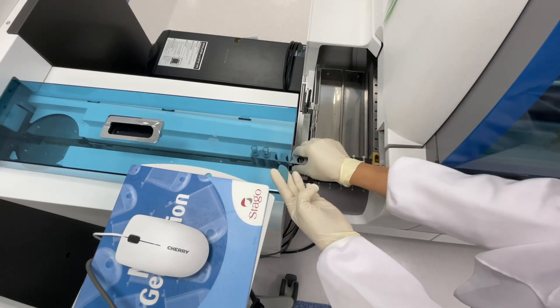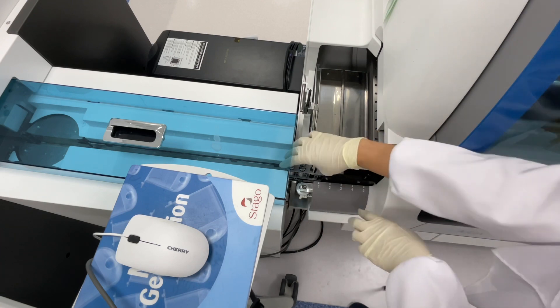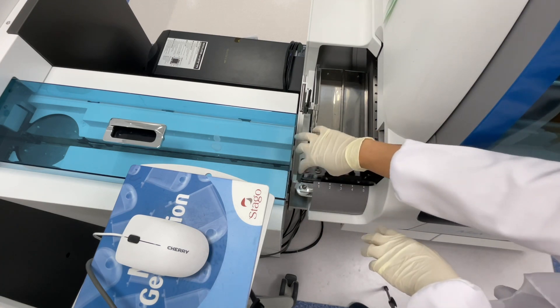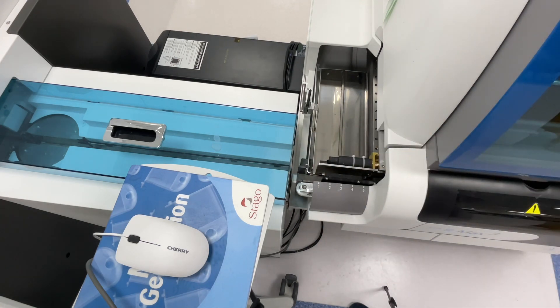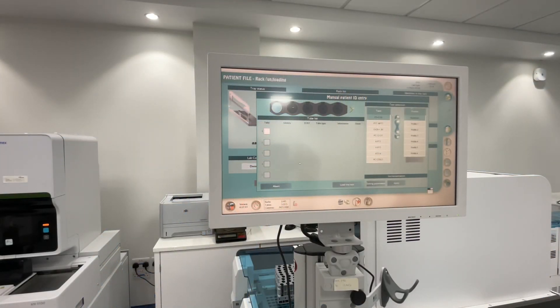Check this group - positions one, two, three, four, five - and push your samples in gently. If you want to add another rack, follow the same procedure. If you have finished your samples, you can click Abort - Abort means stop or cancel.